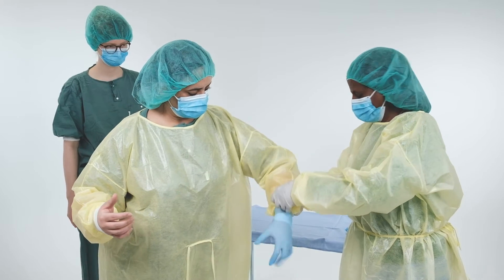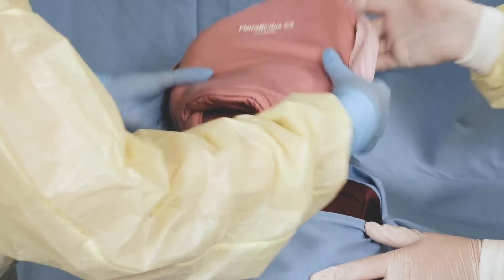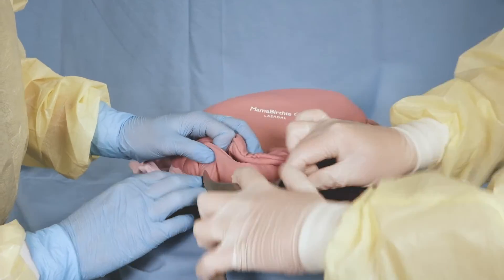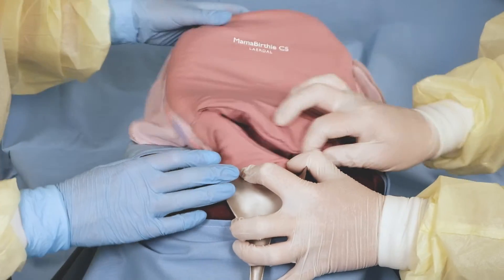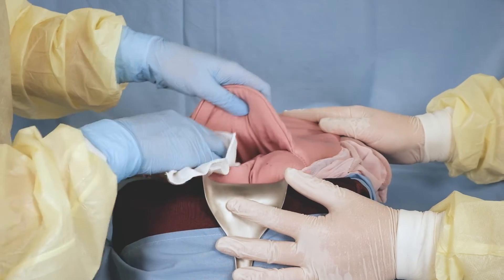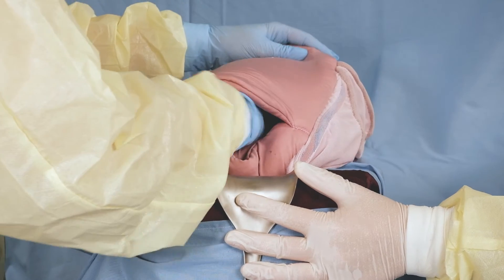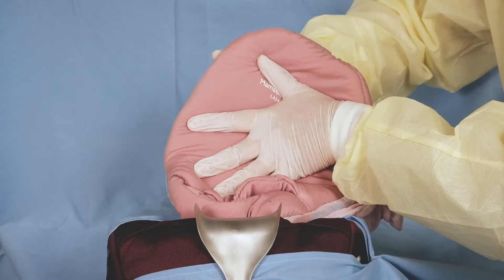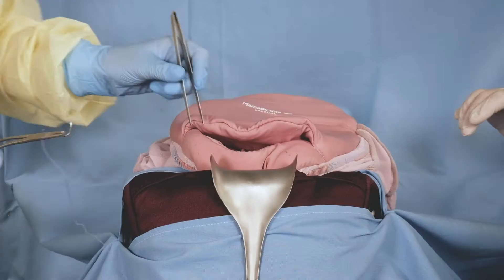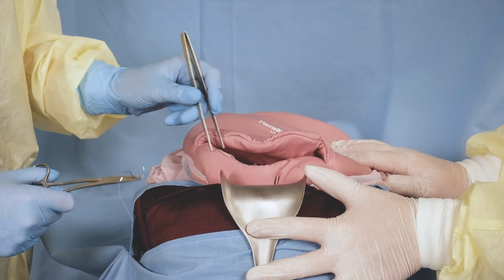The learners should now prepare for simulation. To start, exteriorize the uterus and check it to identify any bleeding points. If the bleeding is diffuse, perform a bimanual compression and assess if the bleeding is controlled. If bimanual compression is successful, proceed to place the compression suture.